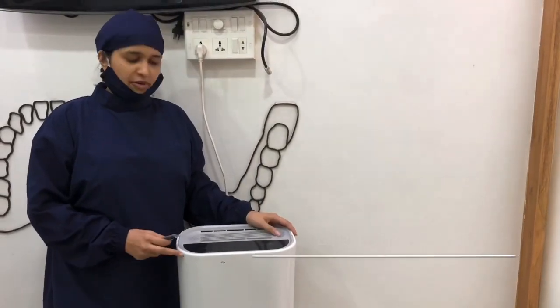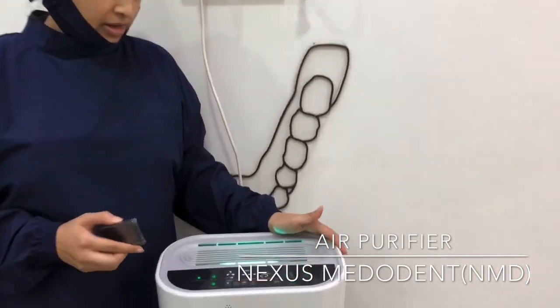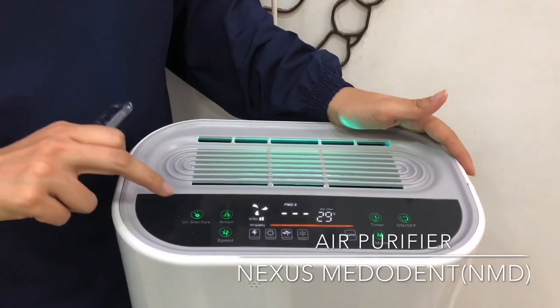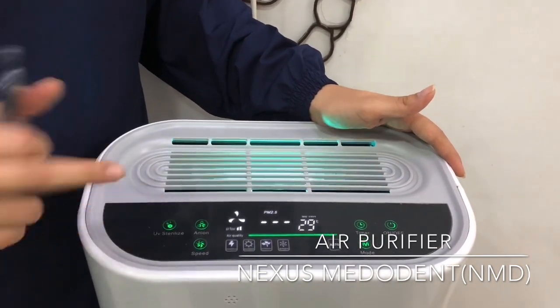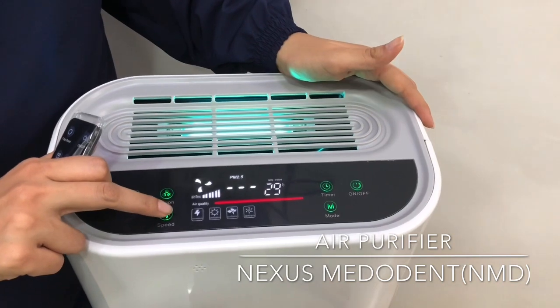Once you install the filter inside, it comes with a remote control. As you can see, there is a touch panel as well as a remote control — you can operate it from here as well. The UV sterilization you can switch off from here or keep it on. This is the negative ion button. There are 3 speeds: low, medium, high.